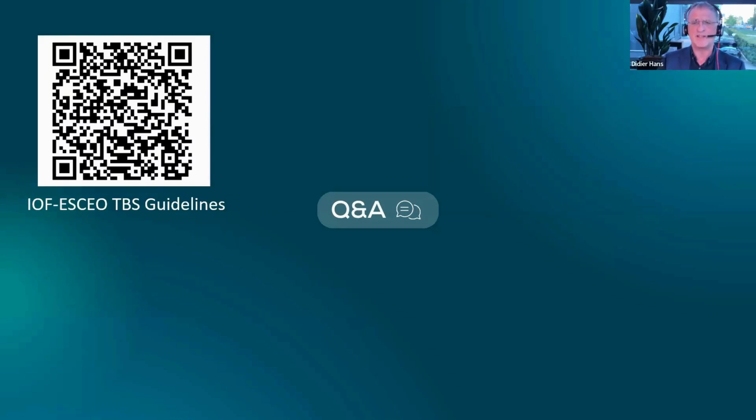So more questions. From Rodman: I'm in private practice and have Prodigy, so I don't see the question. If the question is, can you use TBS on a Prodigy? The answer is yes. I have another question: how do you calculate LSC for TBS? You can use the LSC calculator from ISCD. That will be exactly the same thing.